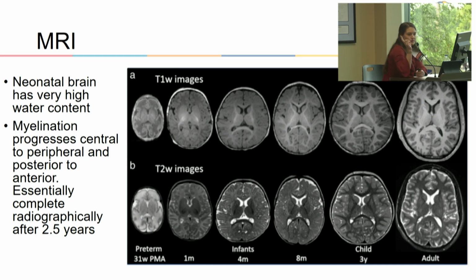And the rate at which they relax back to their resting state depends on the different substrate of the tissue that they're in. So water's going to look different, fat's going to look different, everything in between is going to give off a different signal. But water is important for MRI because water is H2O and hydrogen ions are essentially protons, right? So the degree of water in tissue is really important in MRI imaging.